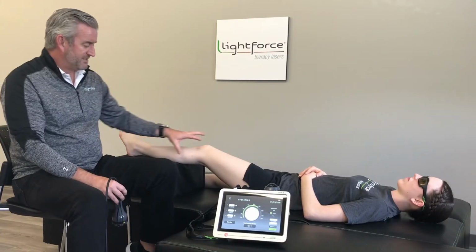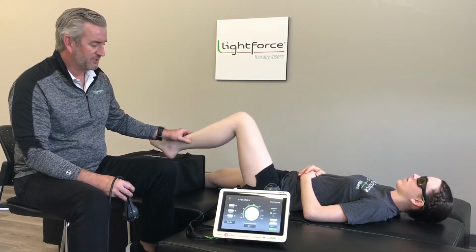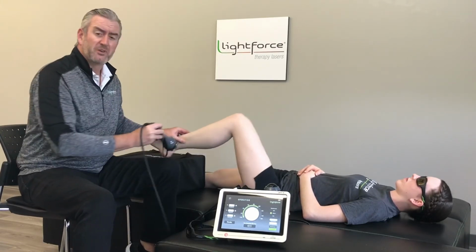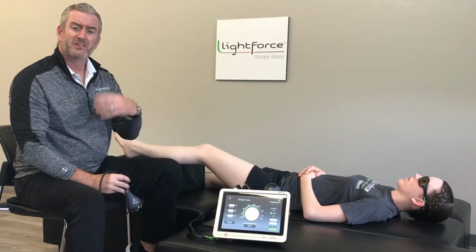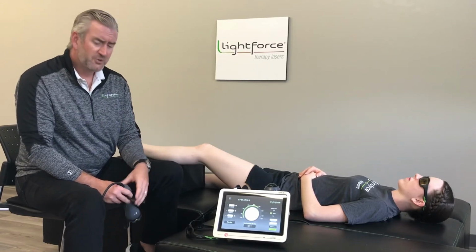The other part of the treatment, if you can, it's a little hard with our setup here, is that while you're treating, try to get some passive or active motion while you treat. So if she could get a little bit of flexion and extension while I was treating her knee, just to incorporate some motion, get some synovial fluid moving, exposing different aspects of the joint capsule, those are all benefits to the treatment. It's easier to do with certain joints than others, but for the knee, it's usually pretty easy if they're on the table and you get them to slide. The key is that you don't want it to be painful though. We're trying to bring pain down, so it should just be a very pain-free motion, whether it's passive or active.